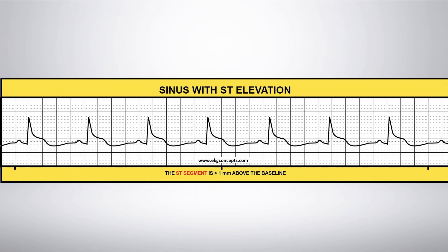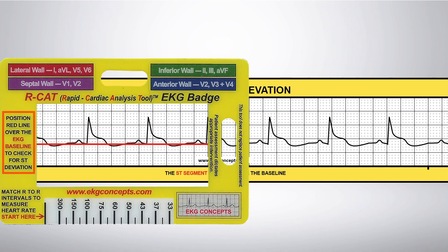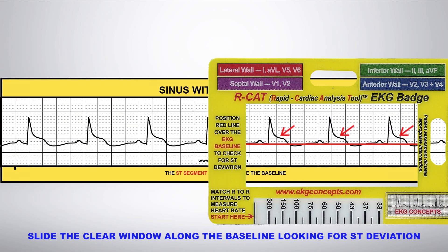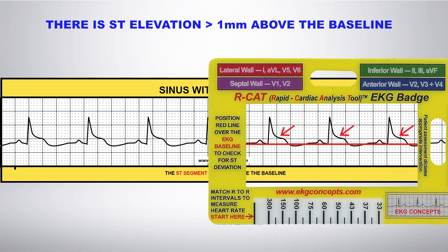Slide the red line of the EKG badge on the baseline and look for ST deviation. Notice how the S wave does not come down to the baseline and the S wave and T wave come together to form ST elevation. Here you see ST elevation greater than 1 mm above the baseline.